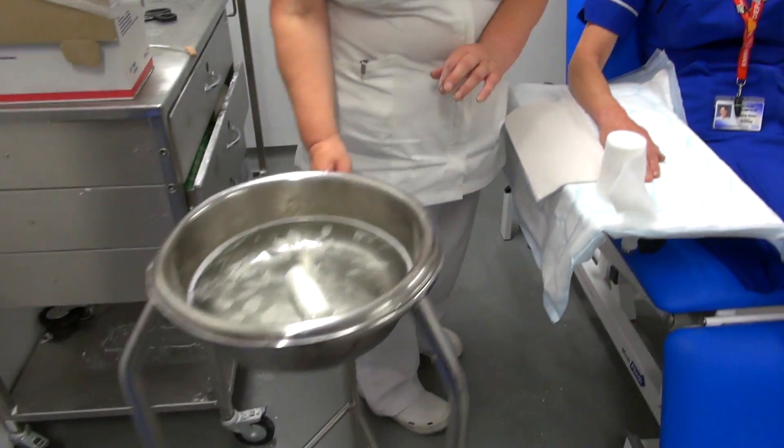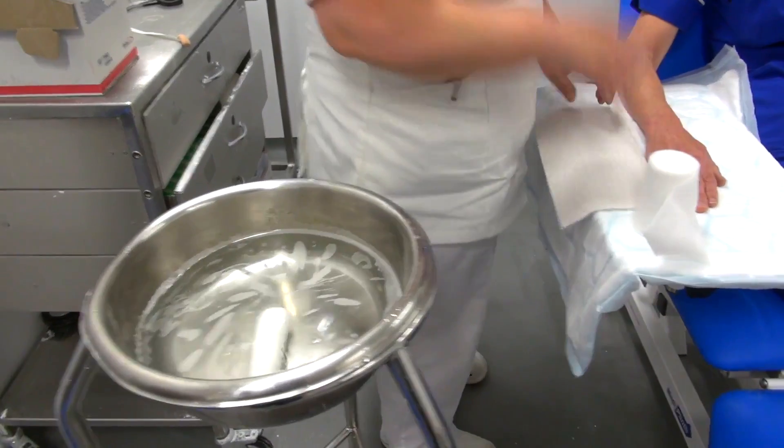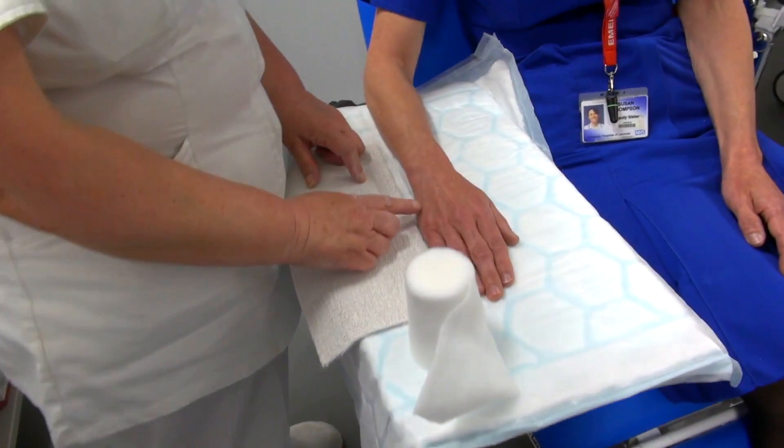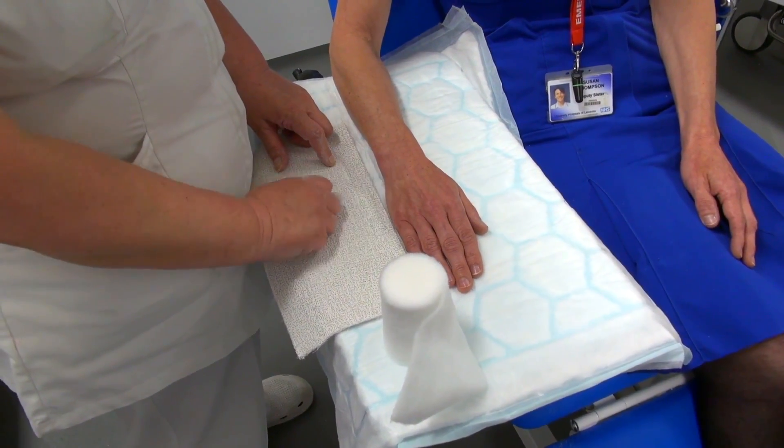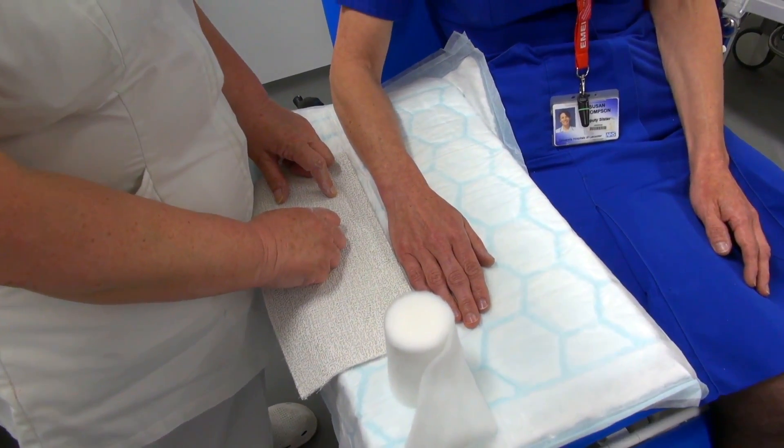Padding, bandage — the bandage is pretty snug. We're putting this on for either the base of the 5th metacarpal or the 4th metacarpal fracture. That's all you need to use these for.